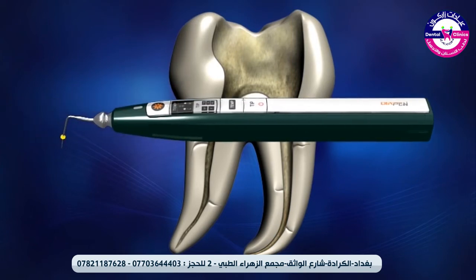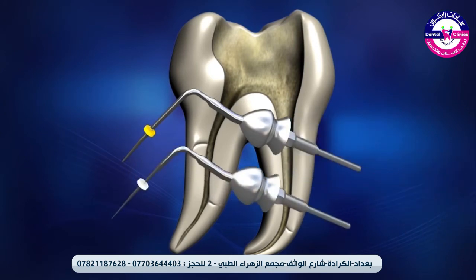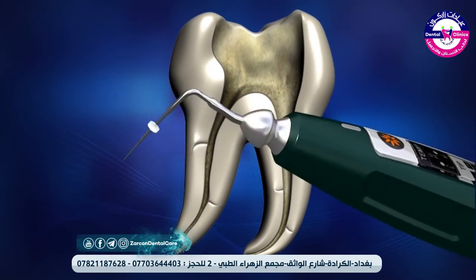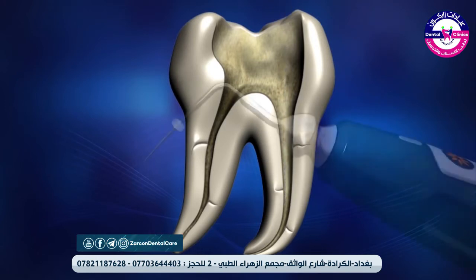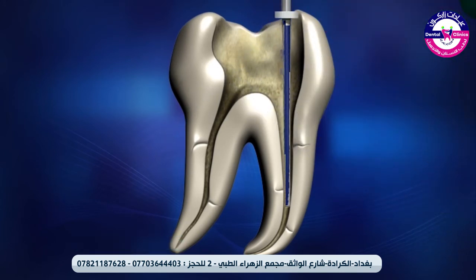It is very important to select the appropriate Dia-Pen tip that most closely matches the size of the prepared canal. To select the appropriate tip, try inserting each size tip one by one. The purpose of this is to measure the length of the canal. Select the largest tip, which can be inserted 3 to 5 millimeters from the apex. Once the appropriate tip is selected, move and set the endo stop according to the measured length.